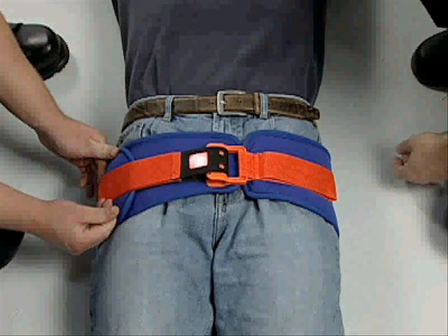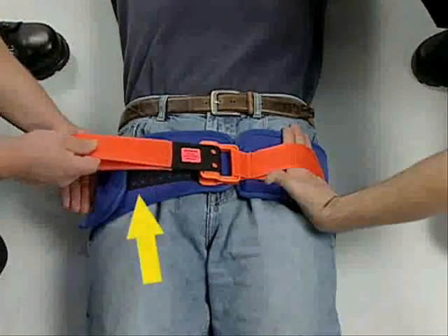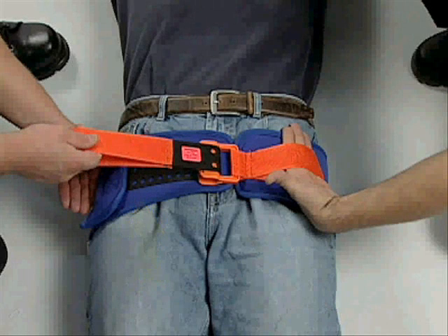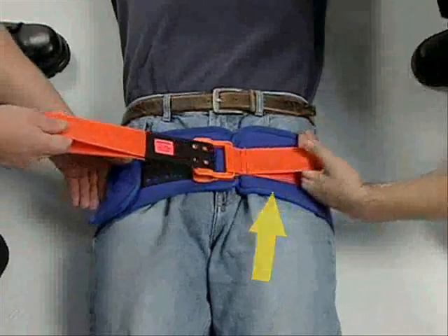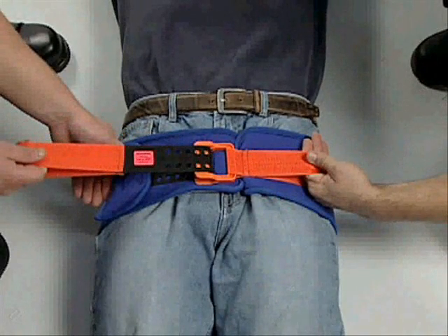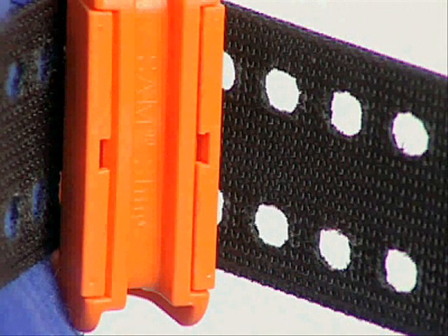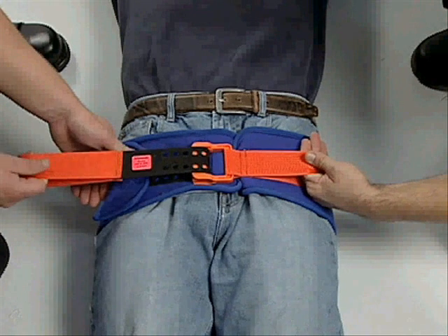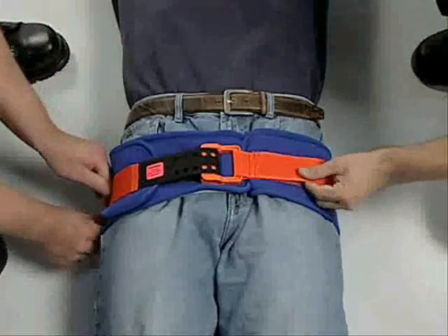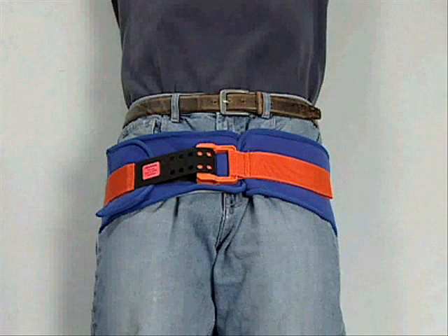Once the sling is secured to the body, hold the padded flap in place and lift the free pull handle away from the flap. Then grasp the fixed pull handle on the other side of the belt and pull the handles in opposite directions. Pull until you hear or feel the buckle click or stop. When you determine the buckle has engaged, do not release tension. Maintain tension and firmly press the free pull handle against the belt. The Velcro hooks on the surface of the free pull handle will secure it in place.